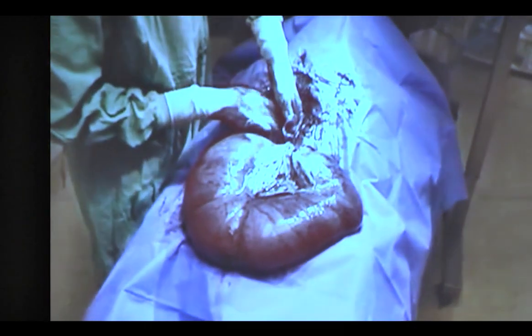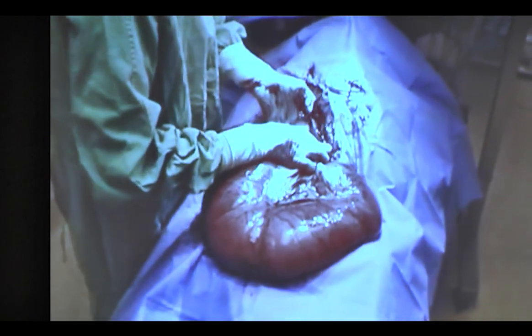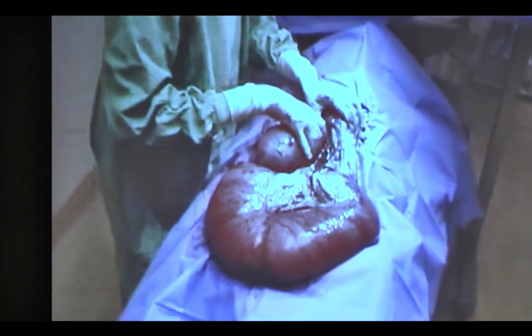She's really digging for it. And this is why you want to have somebody do your C-section that knows what they're doing. Because if you don't, you can rip through all of that and cause severe hemorrhage. Oh, look what happened. There were puppies.